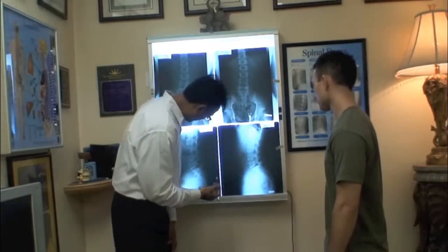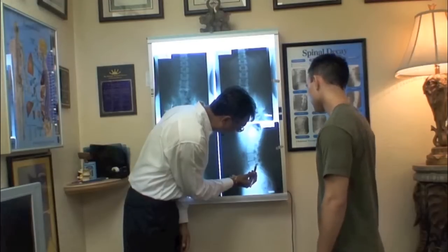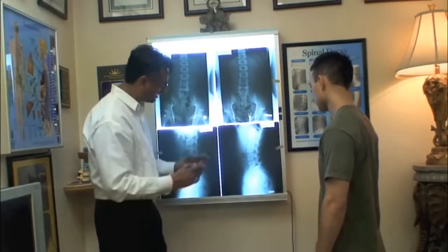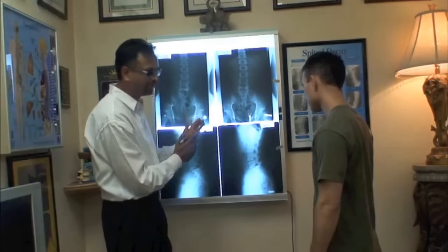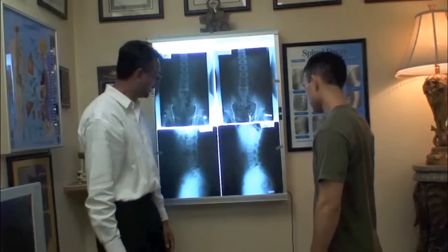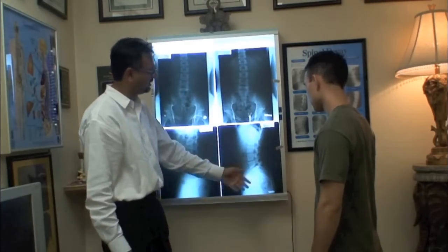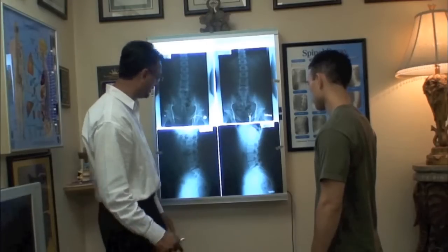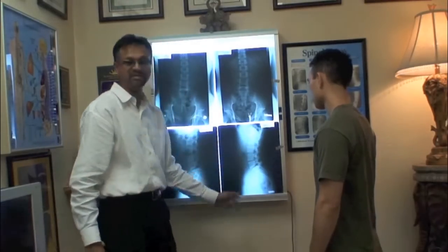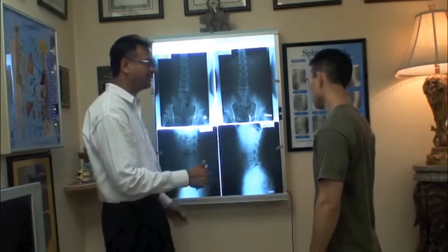The beautiful thing about how much improvement he's had is that this space here, between the edge of this bone and the edge of this bone, is narrowed, which means this joint is in a better position. This condition is called spondylolisthesis, and that really has improved, which is really fascinating. At the same time, the curvature is in a better position, and that's what we're looking for. Okay? Any questions, Chris? No.